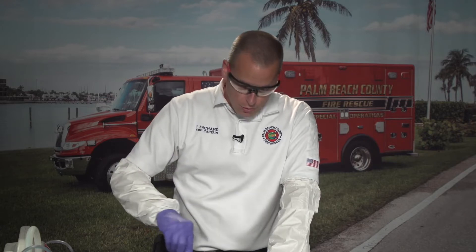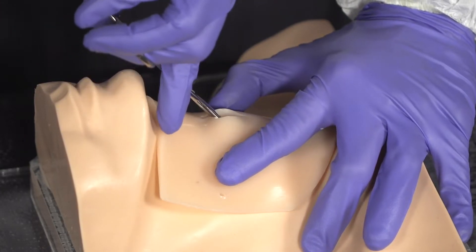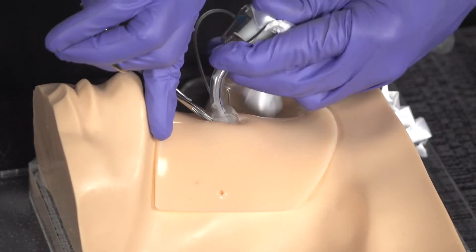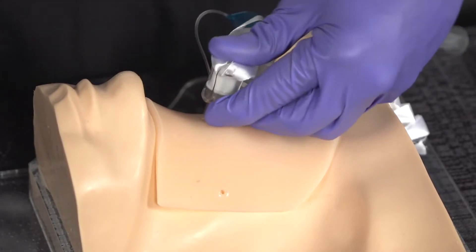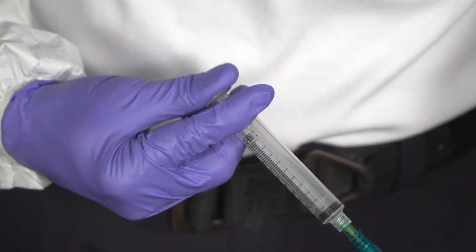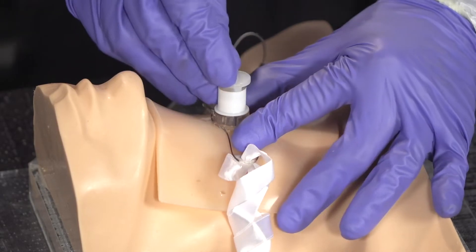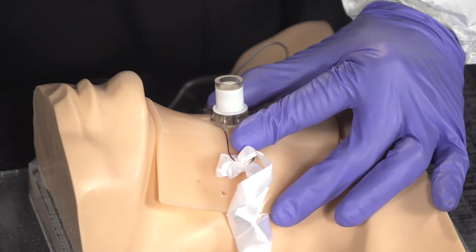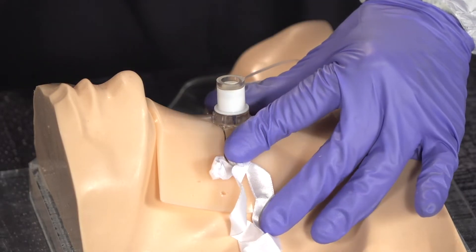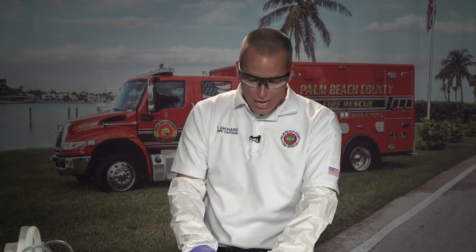Your assistant will hand you the hemostats, which are used to open up the trachea. Once you've got your landmark, quickly insert your Shiley — your cric tube — into the trachea until it buries to the hub, then inject 10 milliliters of air to secure the cuff. Confirm placement by attaching your end-tidal CO2 filter line set and HEPA filter, ventilate with a BVM, listen for equal lung sounds, confirm chest rise, and look for an end-tidal CO2 reading with a box-like waveform.